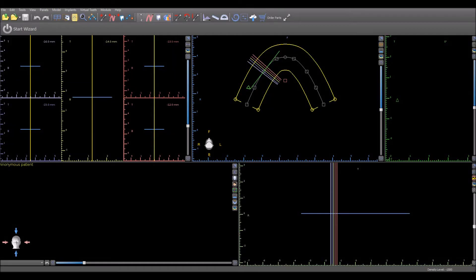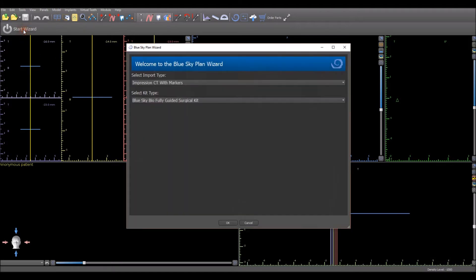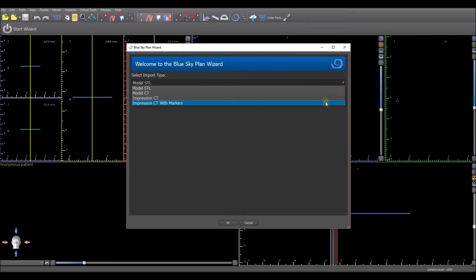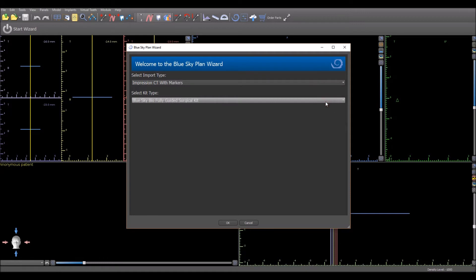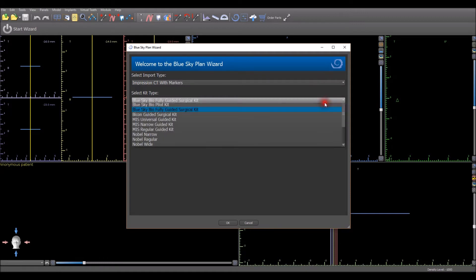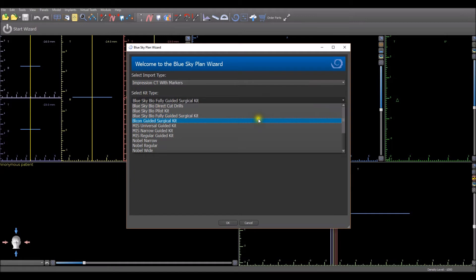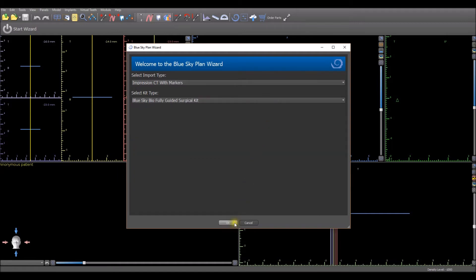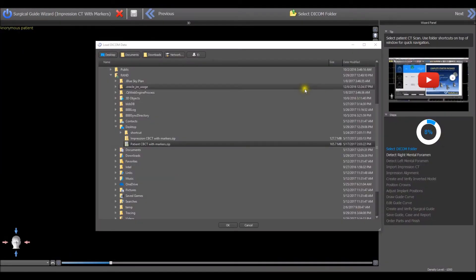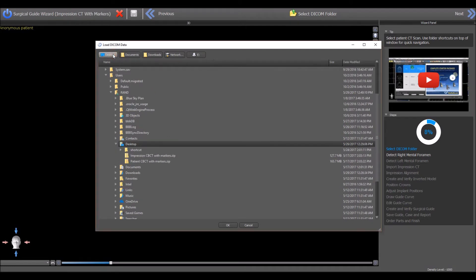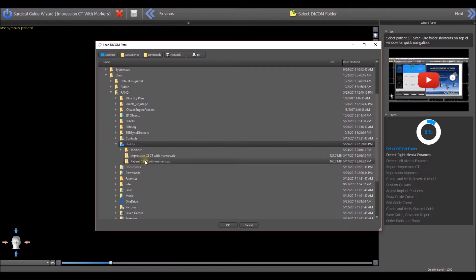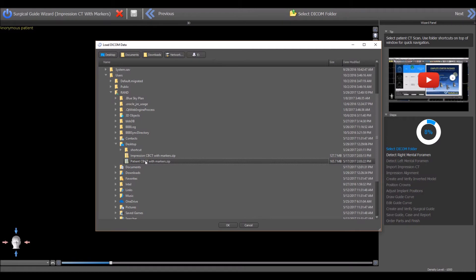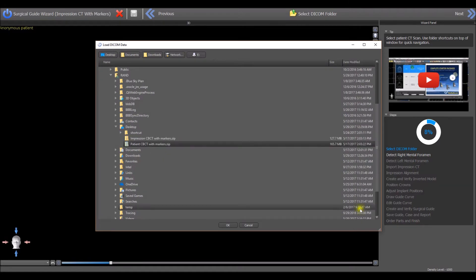Open the Blue Sky Plan treatment planning software and press the Start Wizard button. From the drop-down lists, select the option to import an impression CT with markers and the Blue Sky Bio fully guided surgical kit. Press the OK button. Press the Desktop button in the top horizontal toolbar to navigate to your computer's desktop and select the file patientcbctwithmarkers.zip. The software can load compressed DICOM files, uncompressed DICOM files, as well as zipped CT scans.